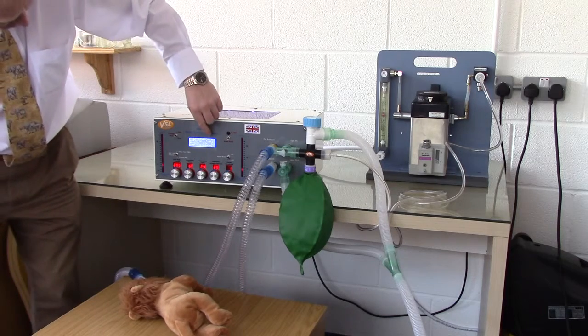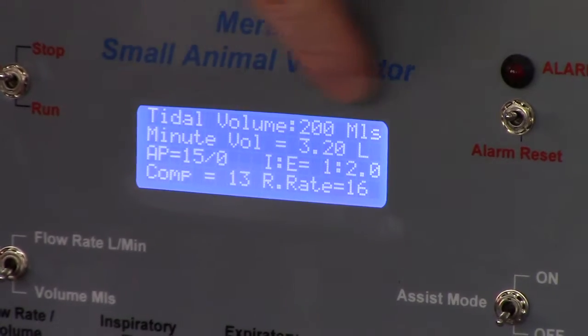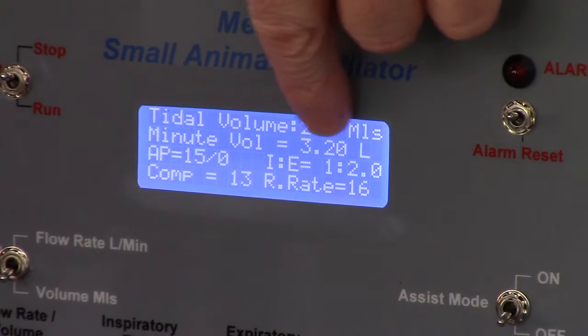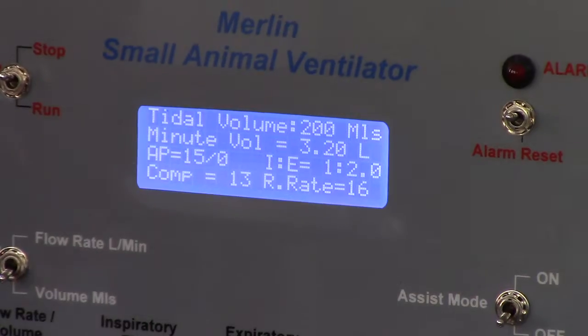The main screen shows all the ventilation parameters. The top line is the tidal volume, which is 200mL, then the minute volume at 3.2L, and an IE ratio of 1 to 2.